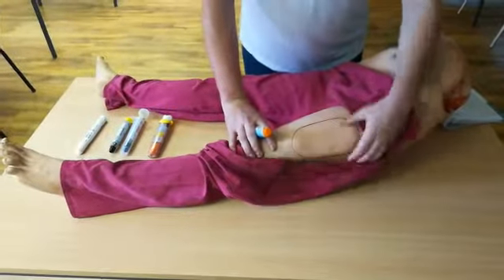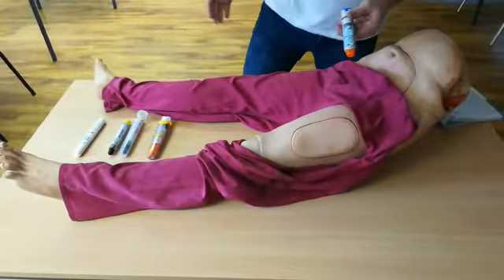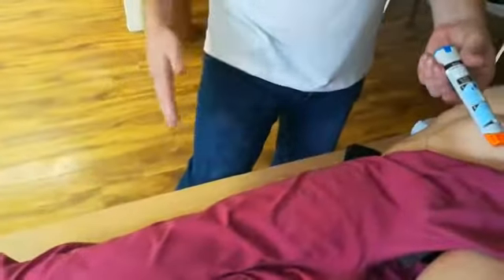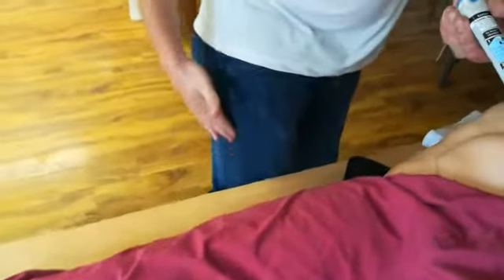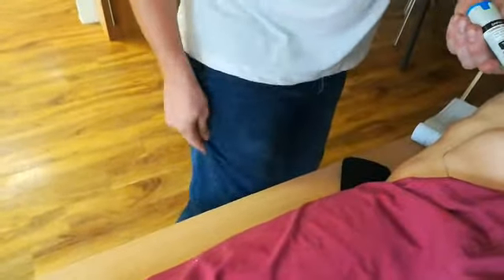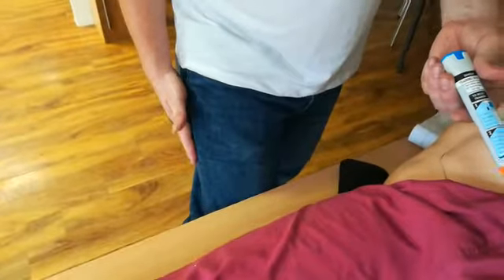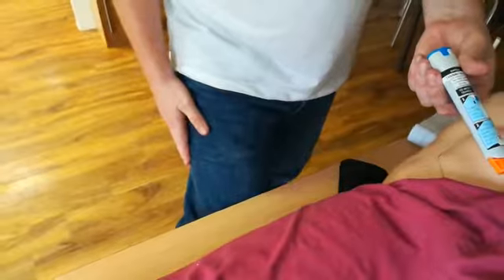We're looking for the upper outer aspect of the thigh. We need to make sure that if, for instance, somebody's got jeans on like I have, there are no pens, lumps, keys, or money in the pocket. You're making sure you're not near the crease and you're looking for a safe area to use. It will go through clothing, but make sure there are no excessive layers that may damage the needle.